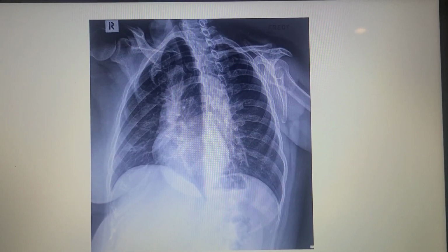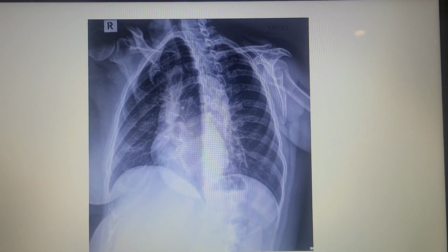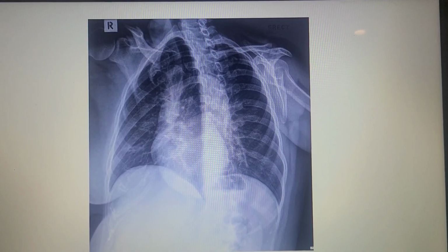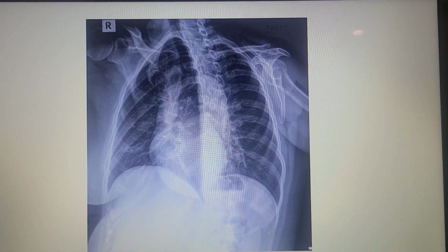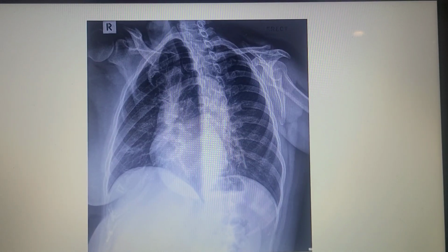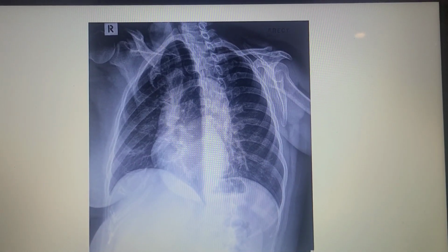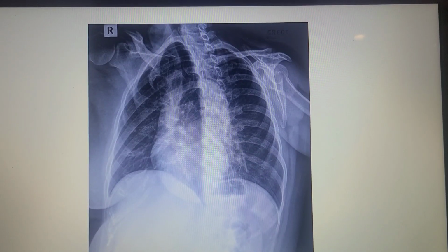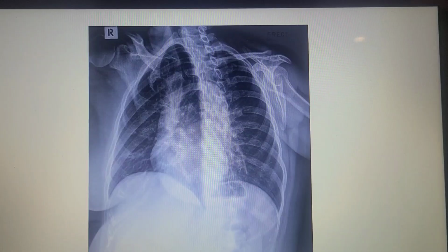It can be difficult to tell if you have under or over obliqued your patient when taking these exposures. However, an easy way to tell you have proper patient angle is to examine their shoulders. On one side, you'll see a Grashey, and on the other, you'll see a perfectly lateral scapula or a scapular Y view. You'll also notice approximately twice as much distance between the vertebral column and the lateral border on the affected side as on the unaffected side.